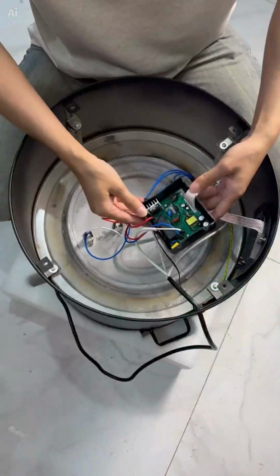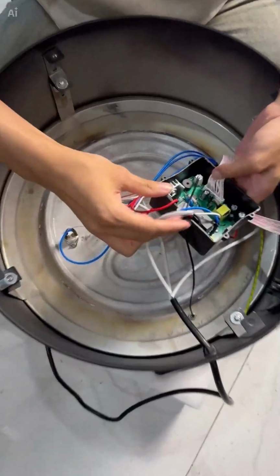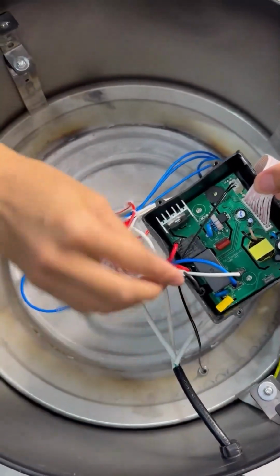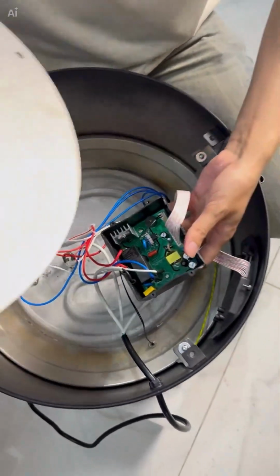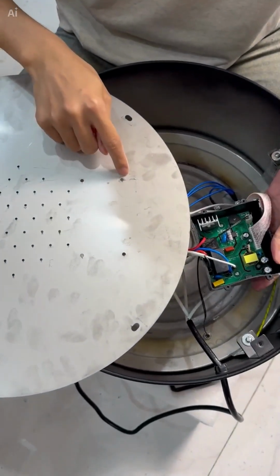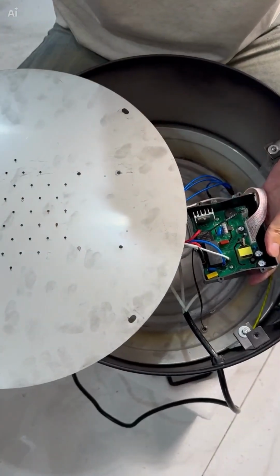Now, these wires need to be arranged into the slots on both sides of the black plastic shell. Okay. Arrange it like this into the slots. Okay, our next step is to align the 4 screw holes on the base plate with the 4 screw holes on the black plastic shell.